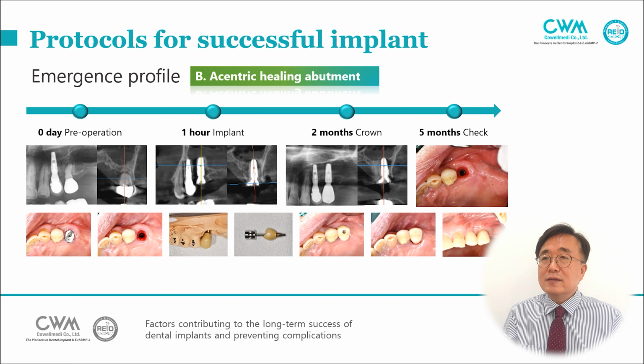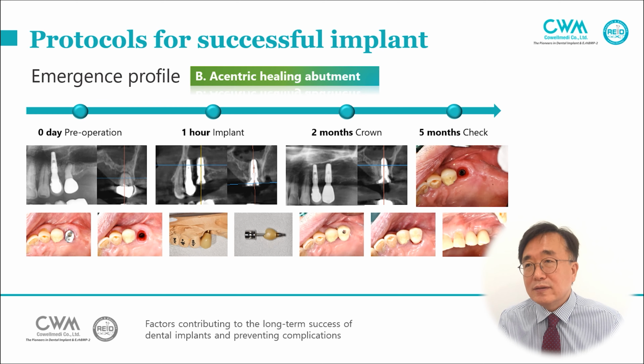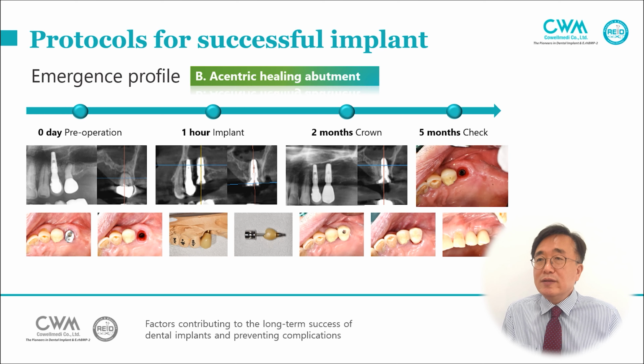And we can reduce the healing period. But there was no palatal bone in the maxilla. The implant diameter was 5 millimeters, so the implant was fixed at about 40 Newton centimeters. The palatal side bone graft with implant and the wide healing abutment.